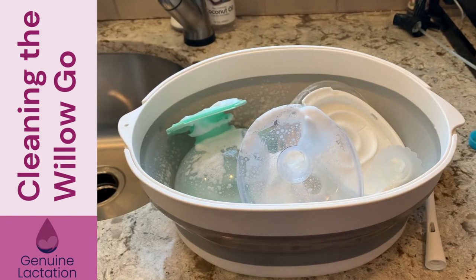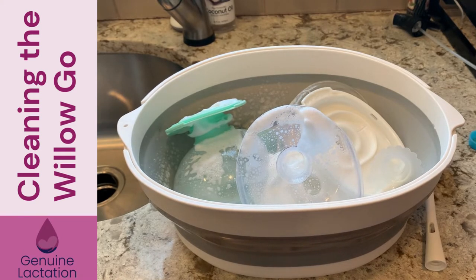Next, we're going to fill this with hot soapy water and let it soak for about 10 to 15 minutes with a good squirt of Dapple. I'm not going to make you watch that, but I will come back when it's time to scrub.